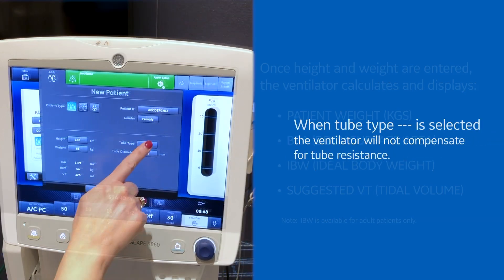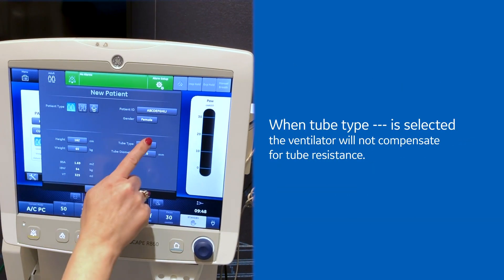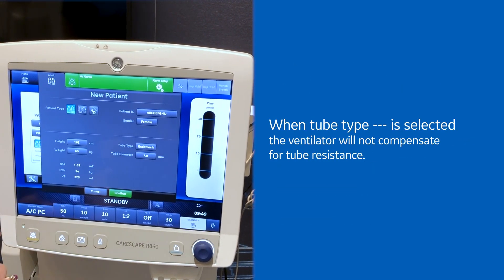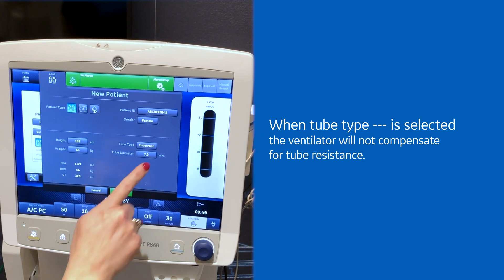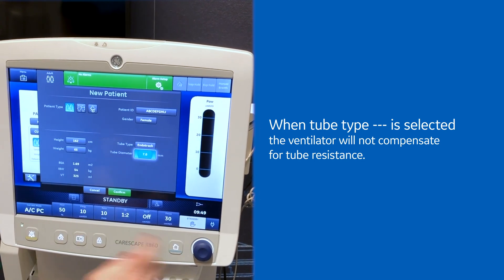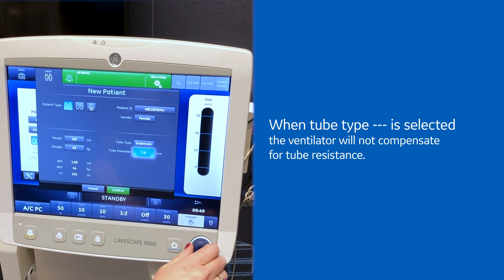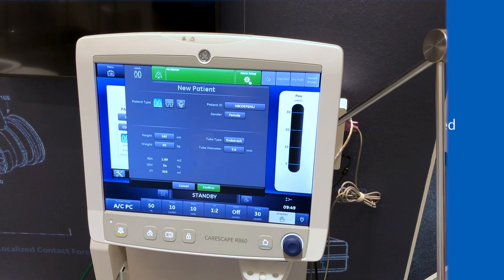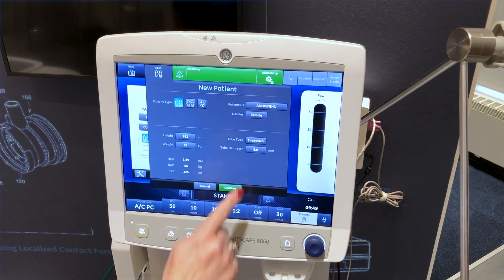Select tube type — either endotracheal or tracheal. Select tube diameter and confirm your settings.